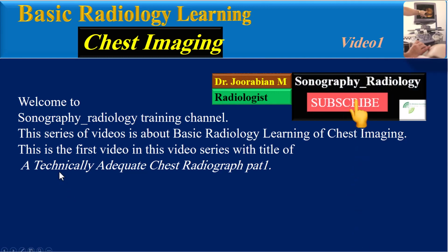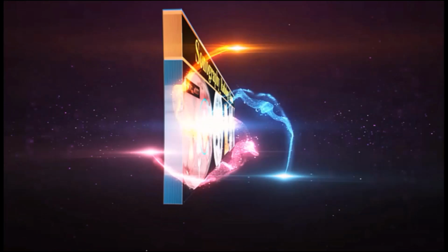This series of videos is about basic radiology learning of chest imaging. This is the first video in this series, titled A Technically Adequate Chest Radiograph, Part 1.